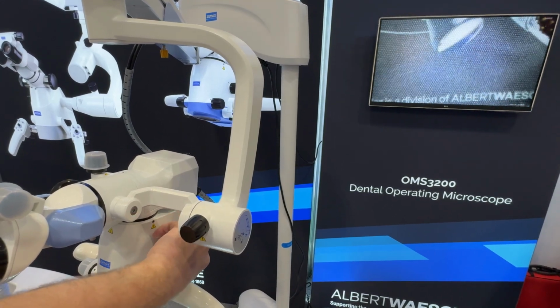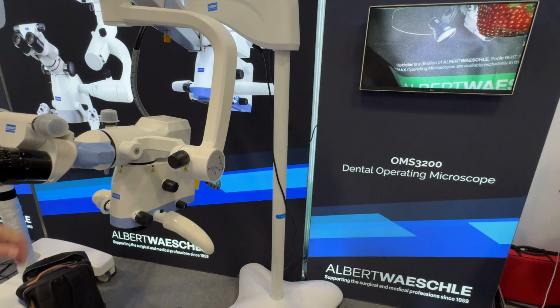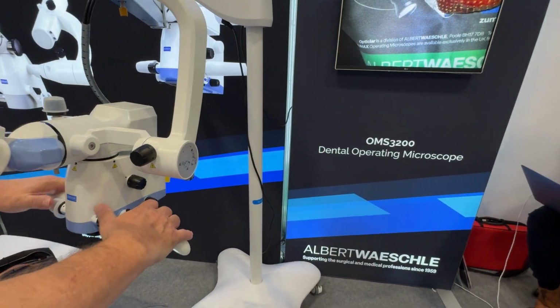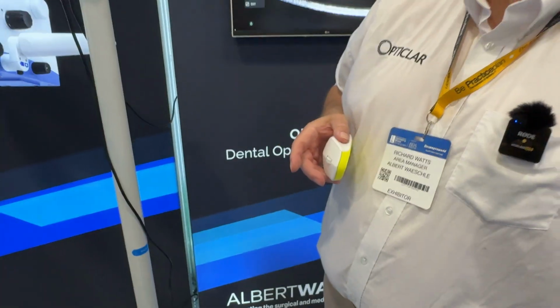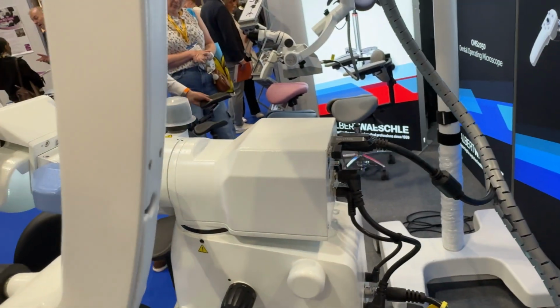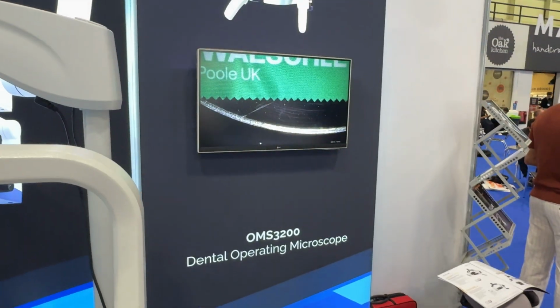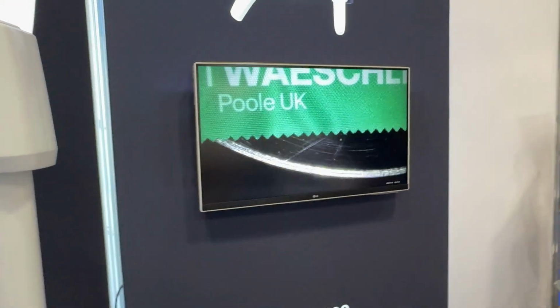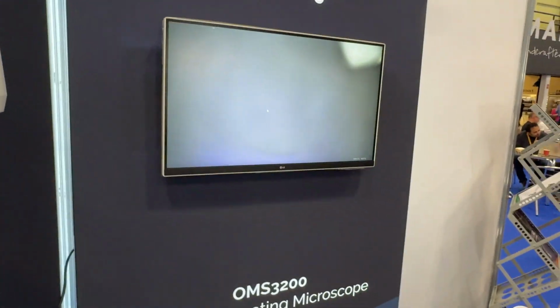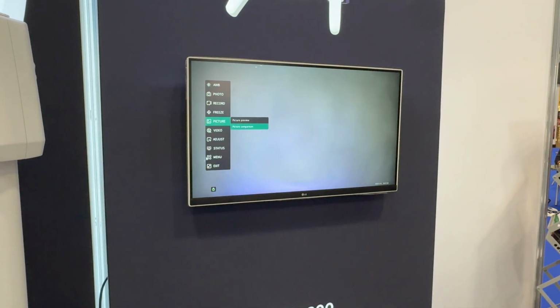It's always magnification to your highest. You might need just a touch of fine focus on it, but it's all there, right where your thumb is. So you put a wireless mouse into the back, and the dongle goes just in there, the other side of the flash drive. Then with the mouse, if you can see the pointer, if you move that down to the bottom left, it brings up the menu.